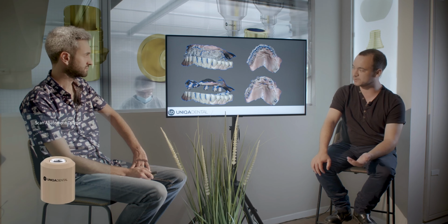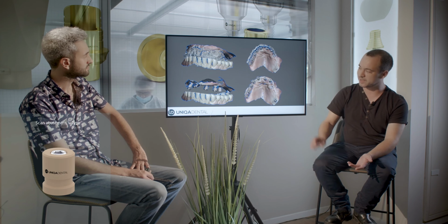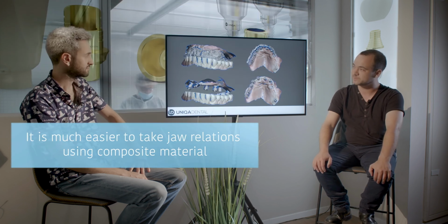So if it was a traditional method, we would take wax, we would know the height, we would know the central line, we would know different elements using wax. But if you want to scan, if you want to use the CAD/CAM advantages, you can't use wax. So what we're using is composite material.